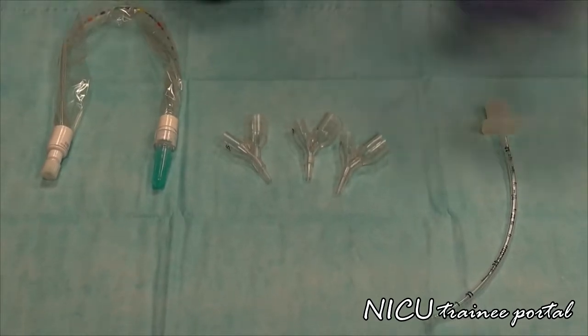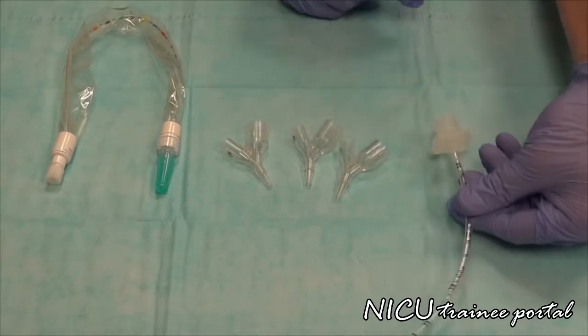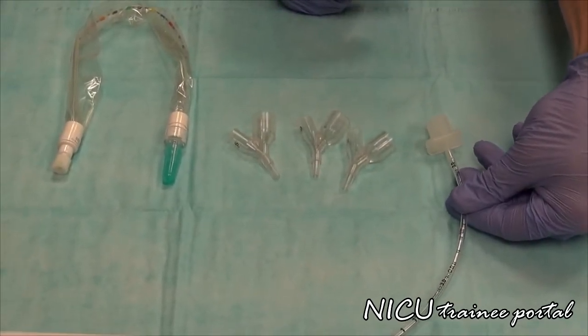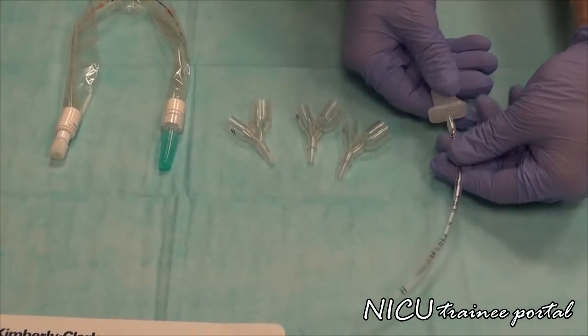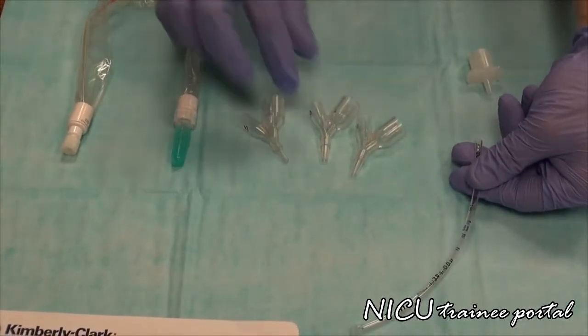For the proper setup, we have a 3.0 ET tube, if we were using that on the baby that we will be giving surfactant. What we do is we remove the stock adapter from the ET tube, like so.